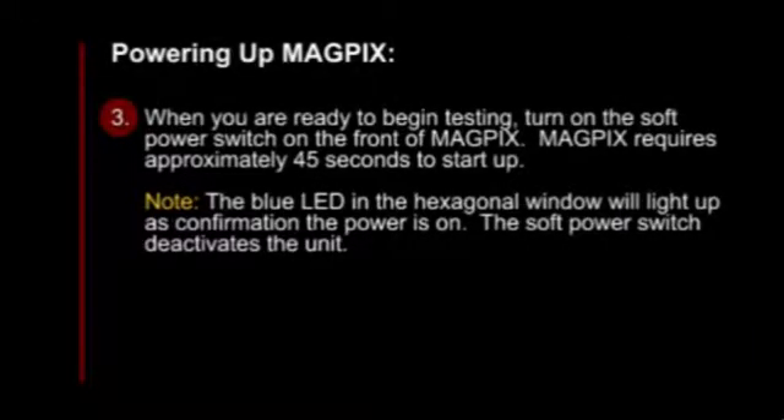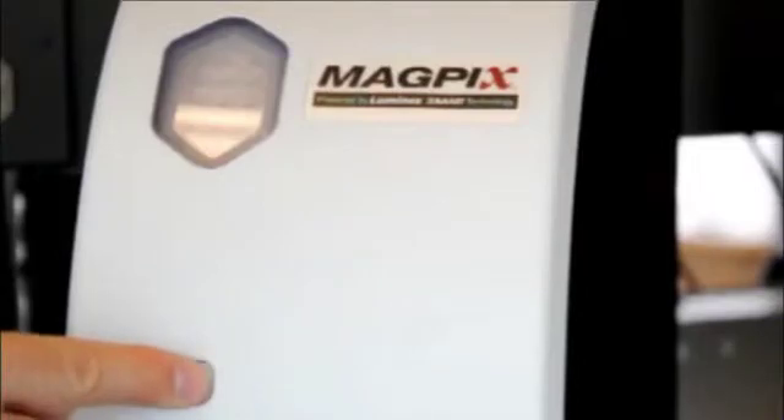When you are ready to begin testing, turn on the soft power switch on the front of MagPix. MagPix requires approximately 45 seconds to start up. Please note, the soft power switch deactivates the unit.